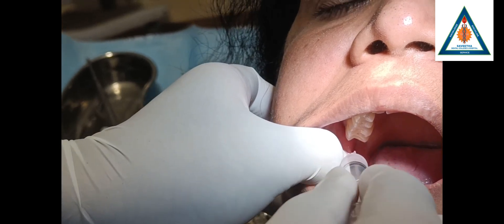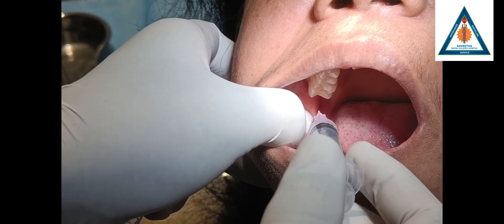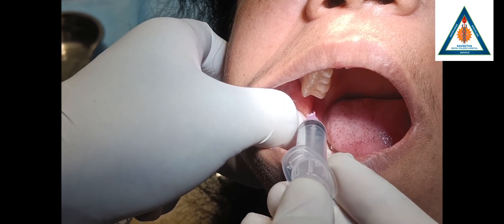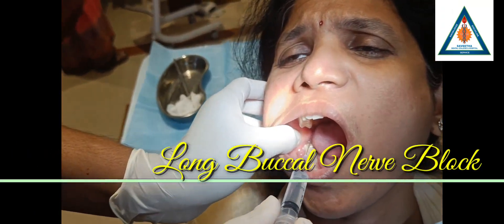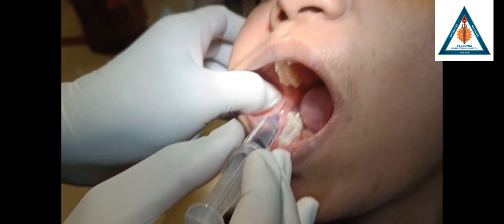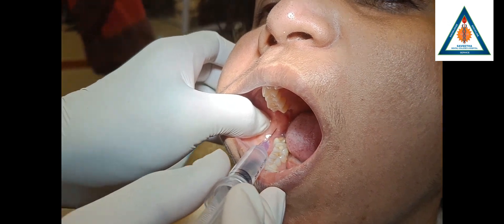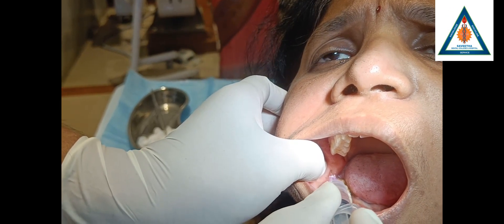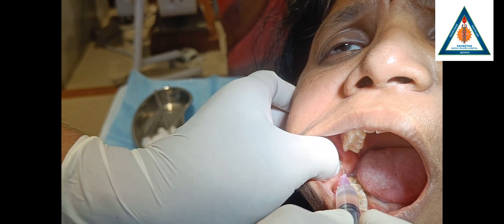Once it is done, I will be coming back onto the same side. Re-aspirate, then deliver around 1.5 ml of solution over this side. Once this is done, retract the needle and secure it. After giving the inferior alveolar nerve block and lingual nerve block, you need to give the long buccal nerve block. The long buccal nerve block is a very easy and simple technique with a higher success rate because it is in the soft tissue. Insert your needle distal to the last molar, hit the bone, aspirate, then deposit around 0.5 to 0.8 ml of solution there.